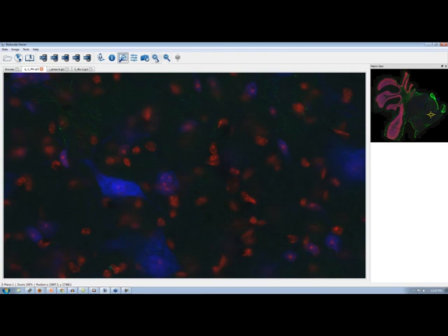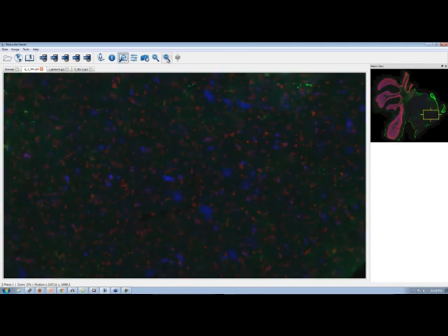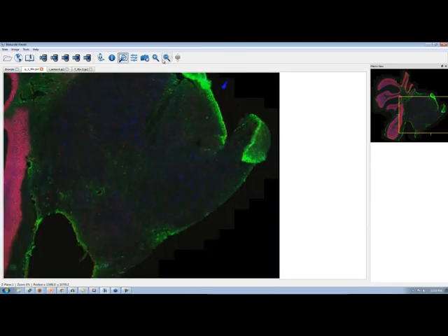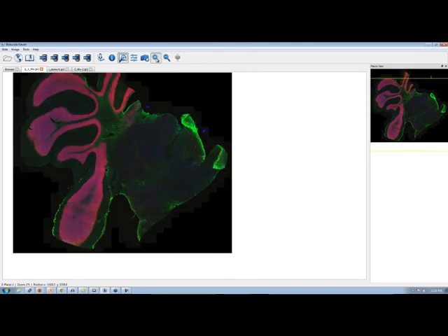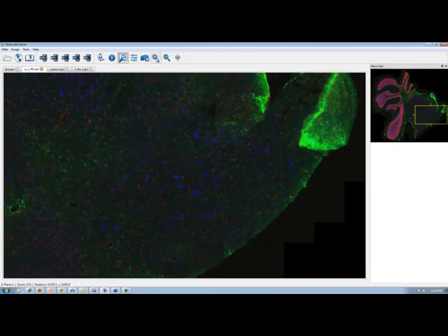Another really simple way is just in the upper right hand side we have a couple icons with a negative and a positive. And that just allows you to click on that and zoom out. You know, a single click will basically change your view once in either direction, and that's a really simple way to zoom in and out.